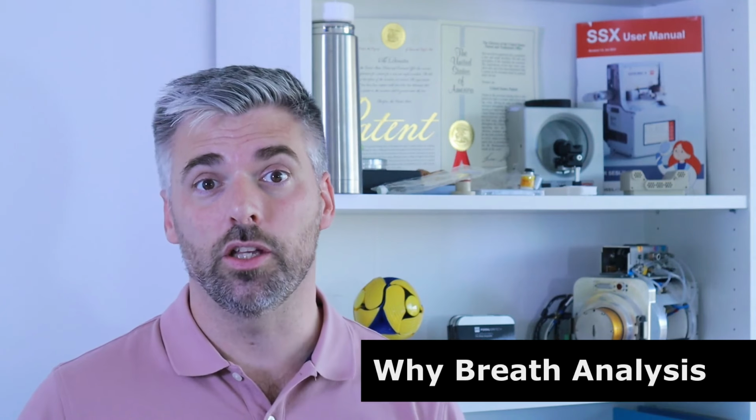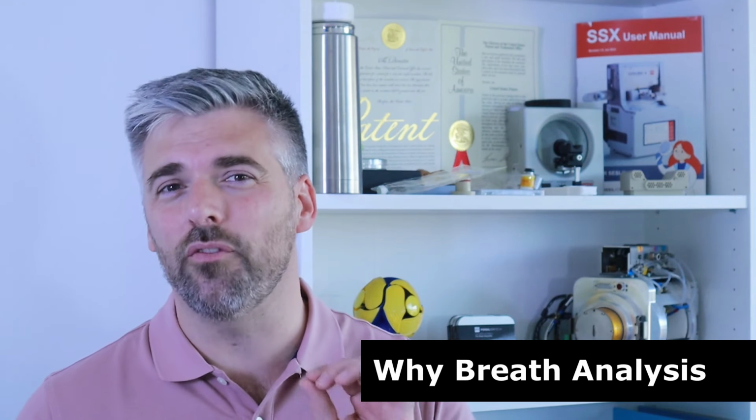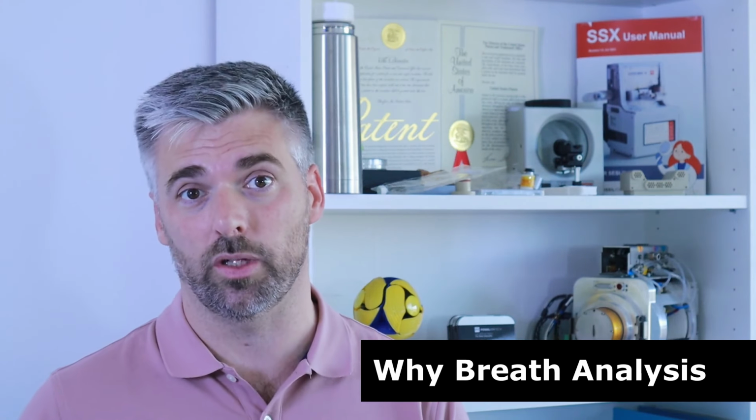Blood tests are widely used, but they are invasive, it takes a lot of time to get the results, and you cannot take blood continuously if you want to track how things are evolving. It's not like we are leaking out blood. But breath? You're already exhaling it all the time, and you can take as many exhalations as you need. It's not just more comfortable, you can capture information that would otherwise be impossible to obtain.